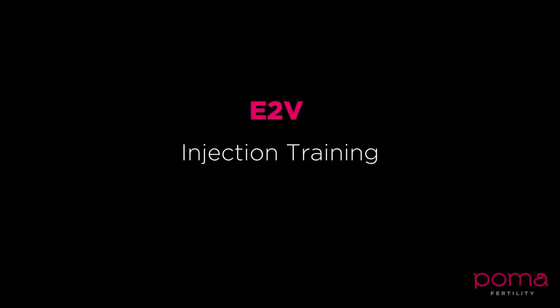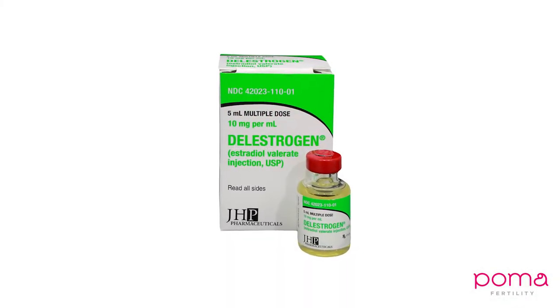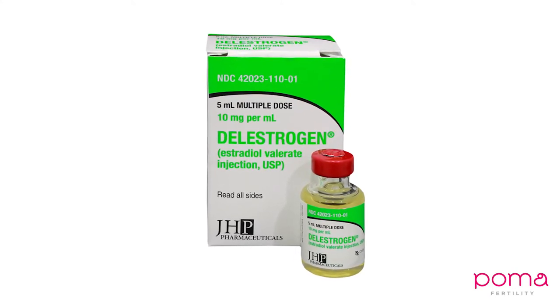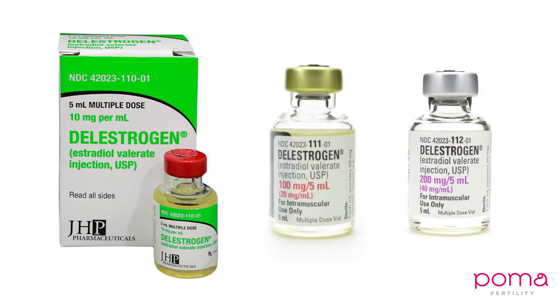Welcome to this tutorial on Delestrogen. First, you want to make sure that you have Delestrogen 10 milligram per ml. If you have another concentration, please reach out to your coordinator as soon as possible, as you will need different instructions.